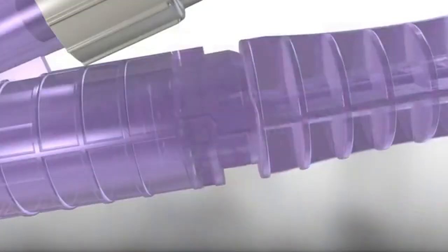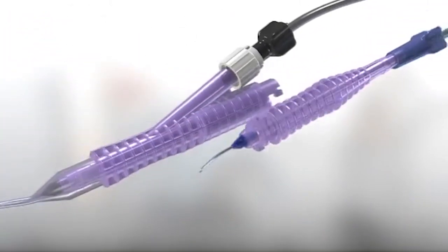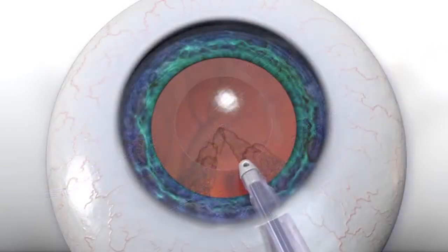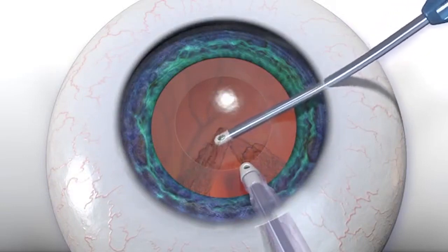By transforming the handpiece from coaxial to bimanual mode, access to sub-incisional cortex becomes easier. The sleeved portion of the handpiece maintains chamber stability through the primary incision, while the transformed aspiration port enters a standard side port incision.